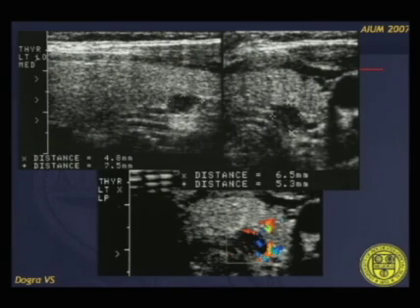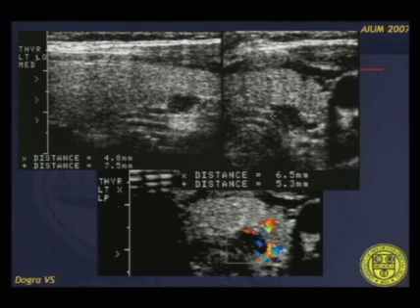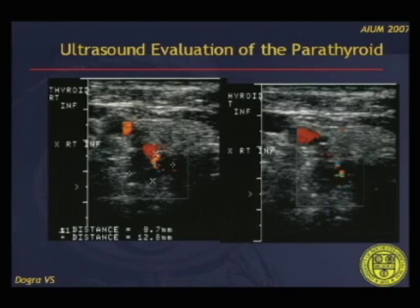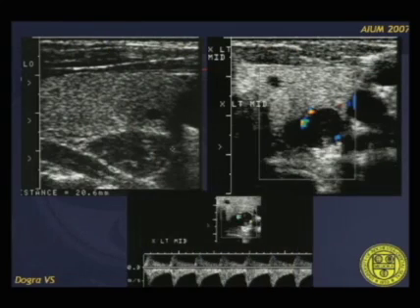This is an example of a polar distribution of color flow. The first two images show the grayscale appearance of a parathyroid adenoma, and the color flow shows the polar sign as described. These are additional examples further demonstrating the polar sign.